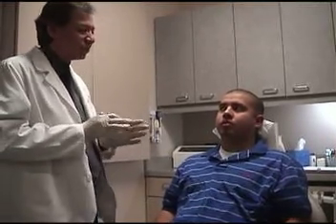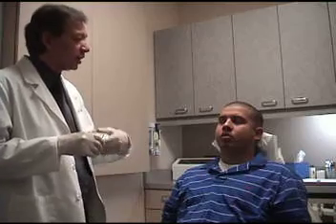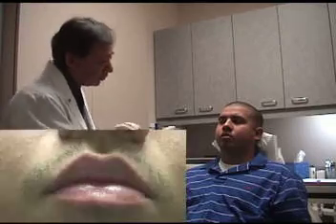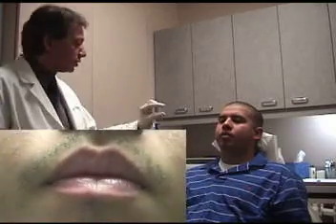Now I'm going to ask you to go ahead and count from 66 to 77, and somewhere along the way I'm going to say stop. And when I say stop, I want you to freeze in that position. So it'd be 66, 67, 68, stop, and then just freeze just like that. Once you're frozen, I'm going to place this on top of your tooth there, and let me just show you what I'm going to do. I'm going to place it, go ahead and close on that, just like so, okay, and open. And then you're going to stay like that.